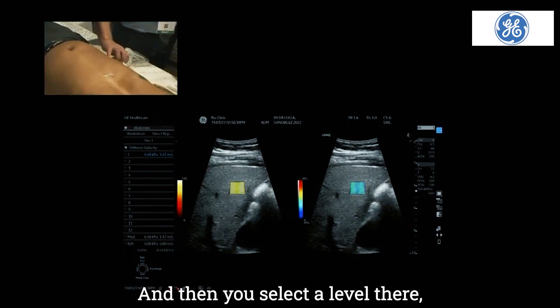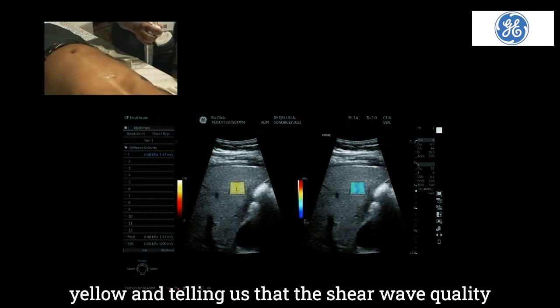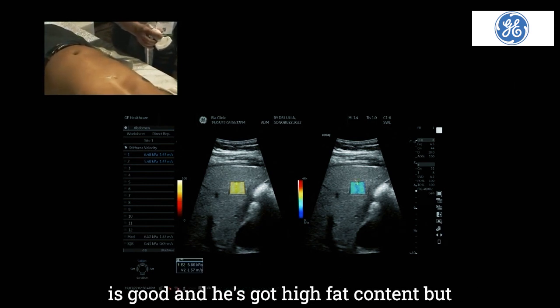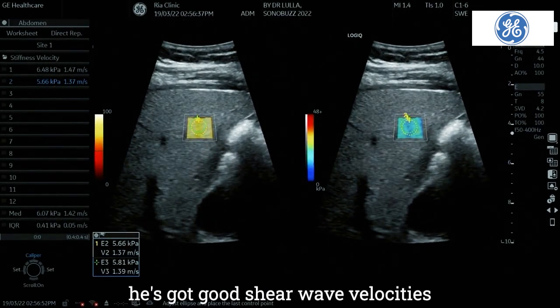And you see the perfect picture, perfectly homogeneously yellow, and telling us that the shear wave quality is good, and he's got high fat content, but he's got good shear wave velocities.